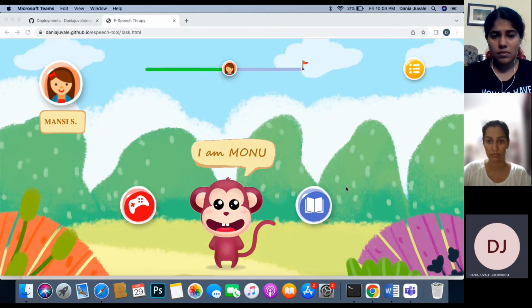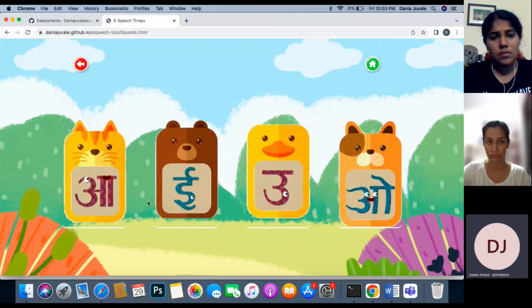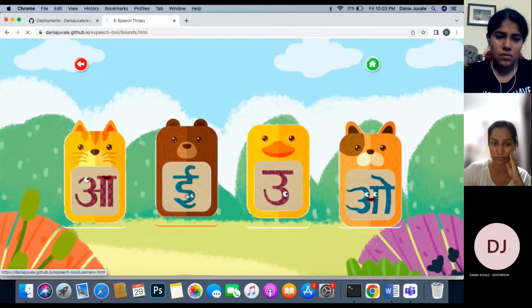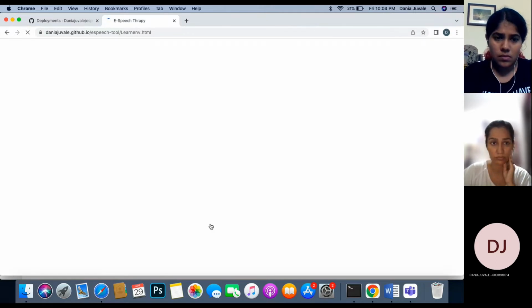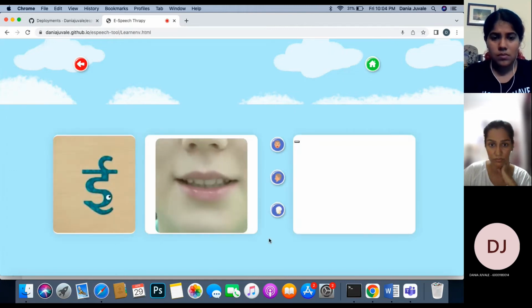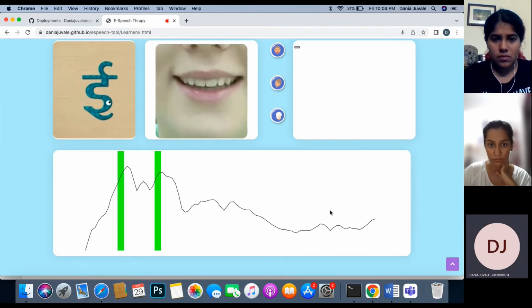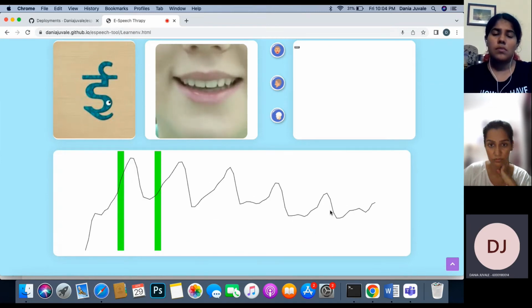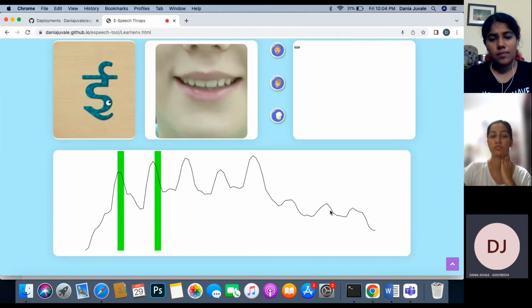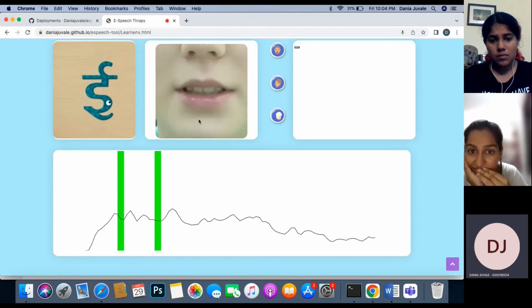So this is the interface design. For now, we have only worked on the vowel E. This is the area where input sound is taken and formants are extracted. For the particular vowel E, we have a set range which will indicate if the vowel generated by the sound is correct or not.